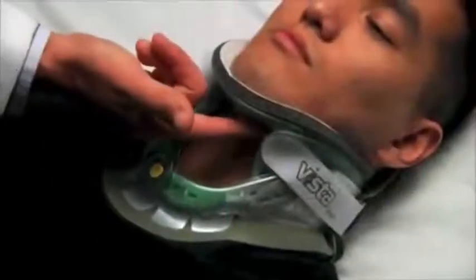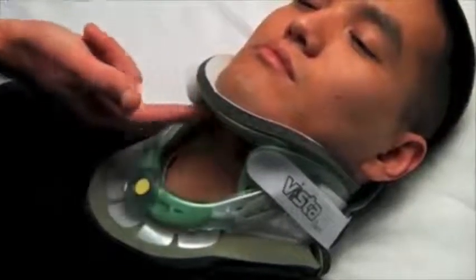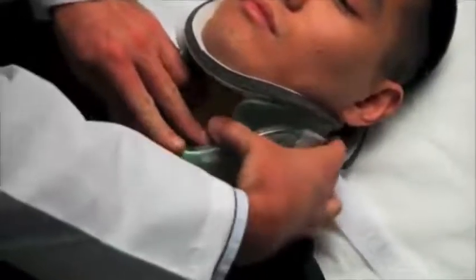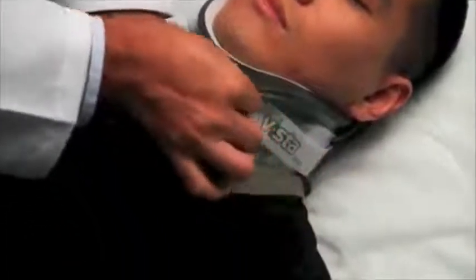Check to see that the back of the chin piece is not pressing inwards on the throat. If it is, lift the back ends of the side panels up off of the trapezius muscles, which moves the chin piece forward and away from the throat.